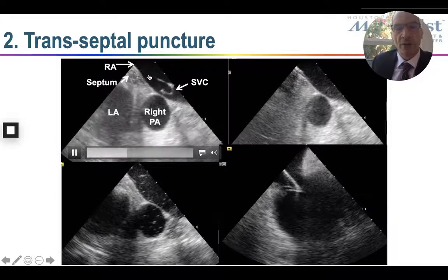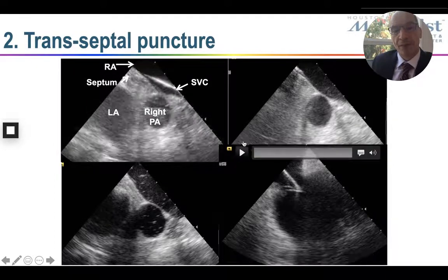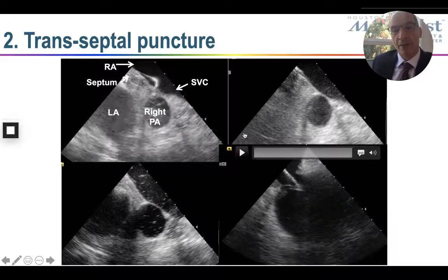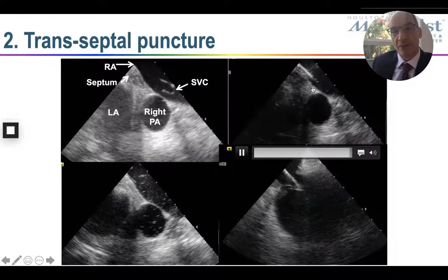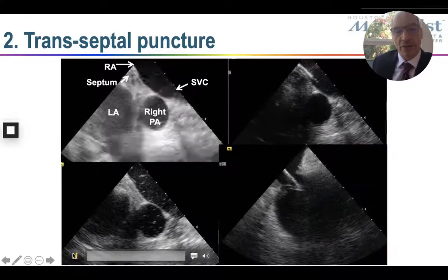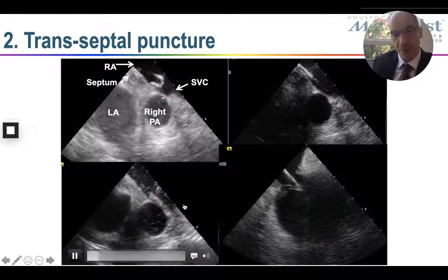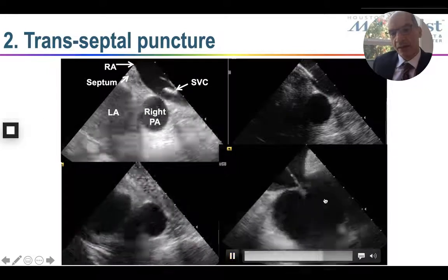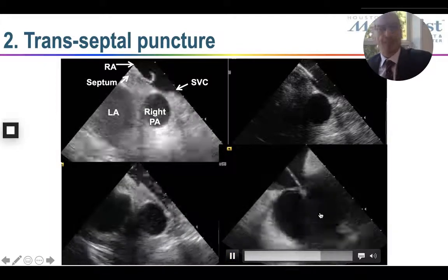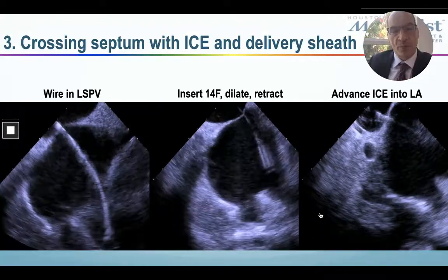We advance the wire into the SVC, then we follow the wire with the sheath. You can see here, you load the needle. I like to flush and see the streaming of saline from the SVC into the right atrium. Then you drag and you engage the fossa ovalis. Then you cross the septum with a wire.